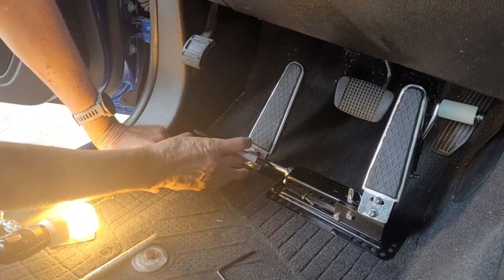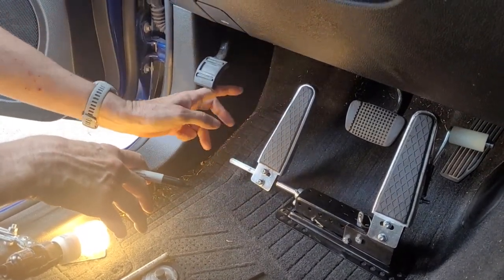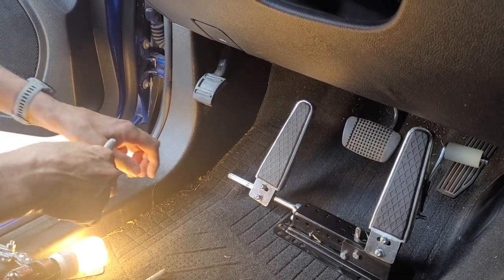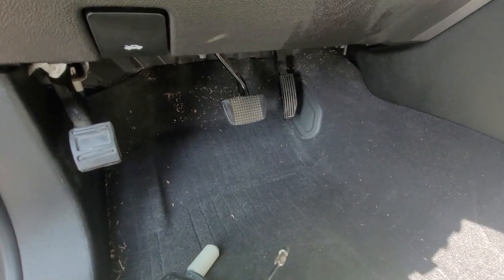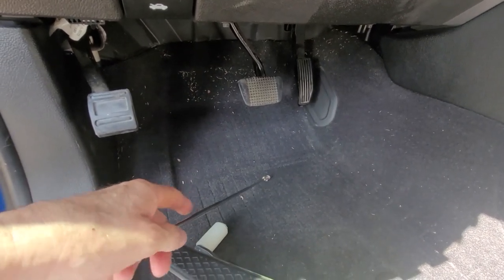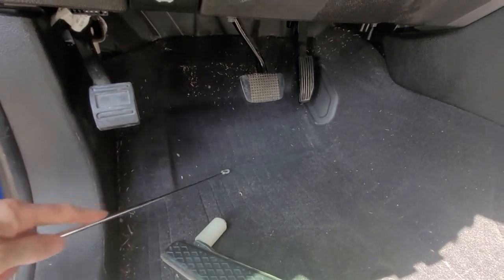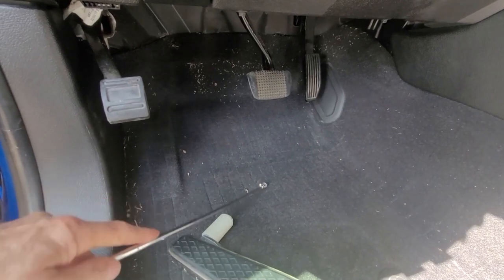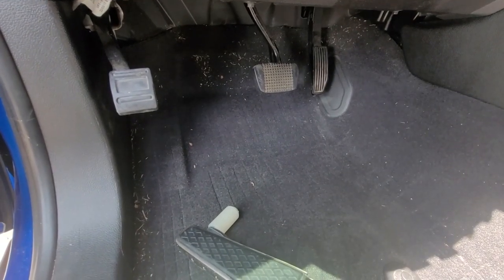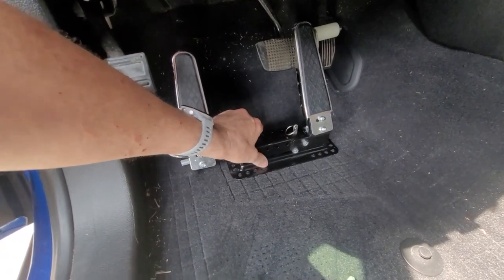I can see where the hump in the floorboard is hitting the rod. I'm going to mark the metal rod with a black Sharpie about a half inch away from that hump, and cut the rod with a hacksaw to make it fit my narrower mid-sized truck. With the rod cut, the assembly is ready to install. But before we drill holes, we need to confirm the assembly position, then look under the truck to make sure there are no brake lines, fuel lines, or anything else in the way of the drill bit.